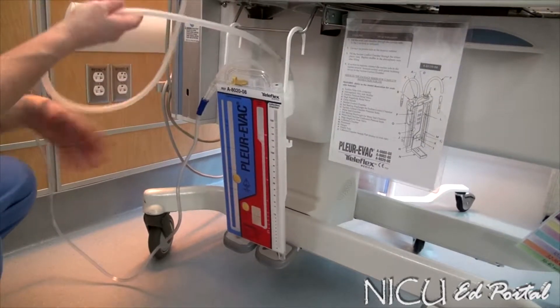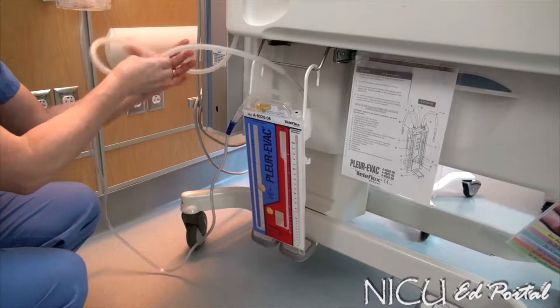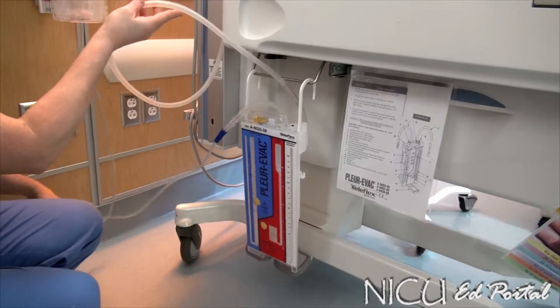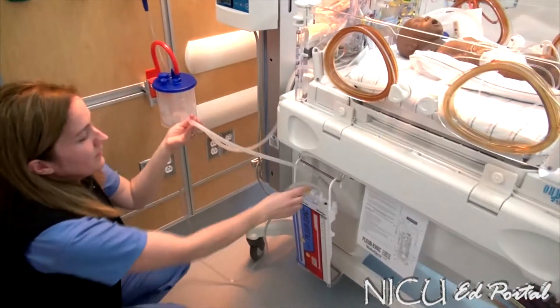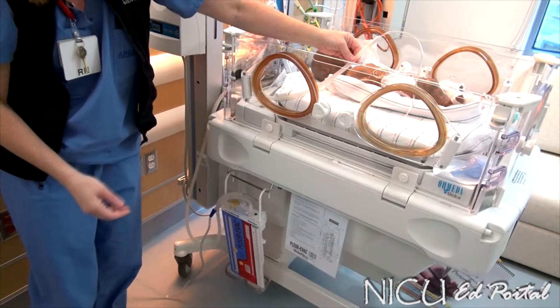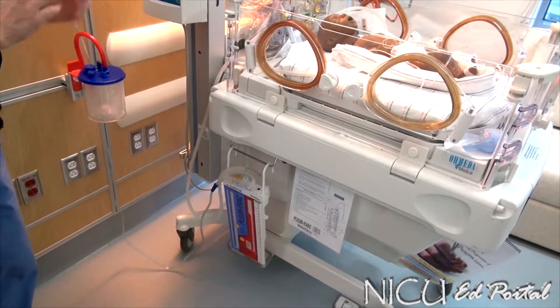The ports on this unit are labeled for teaching purposes, but you need to know that when you open up your package, it's not labeled. This port here is what goes to the wall suction. This port is what goes to the baby — it connects right to the chest tube. Those are really the two ports that you need to make sure go to the right connections.